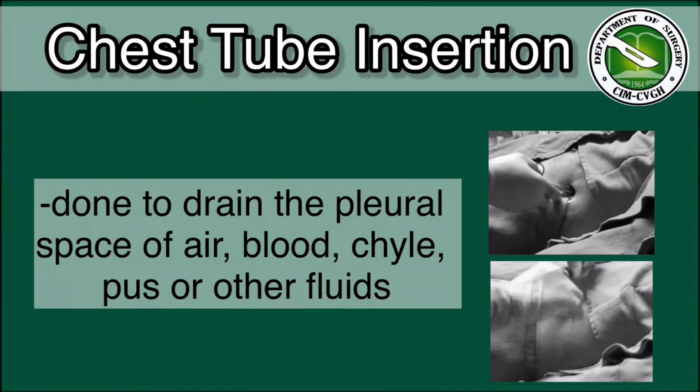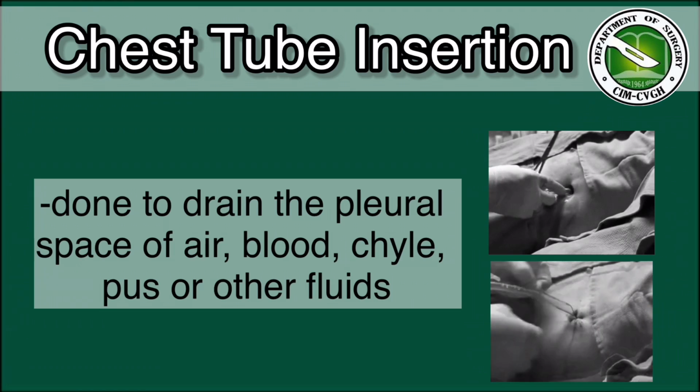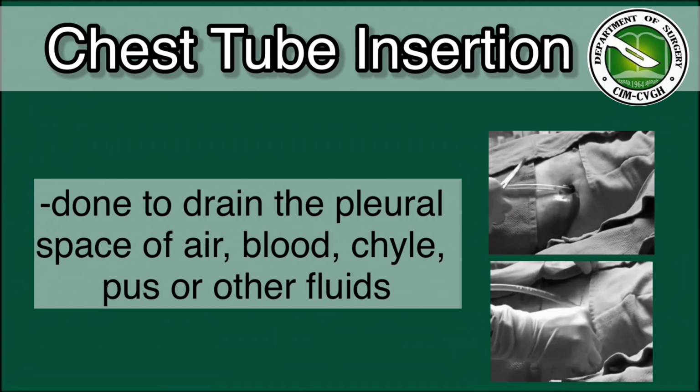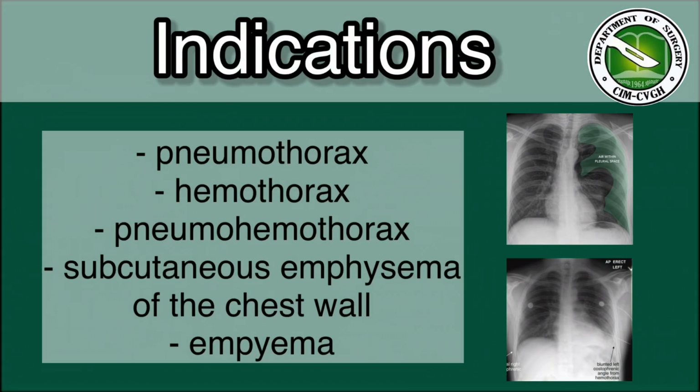Chest tube insertion is an essential skill for hospital doctors dealing with certain pleural diseases to drain the pleural space of air, blood, chyle, pus, or other fluids. It is indicated for pneumothorax, hemothorax, pneumohemothorax, subcutaneous emphysema of the chest wall in a patient who has sustained chest wall trauma requiring ventilatory support or general anesthesia, and empyema.